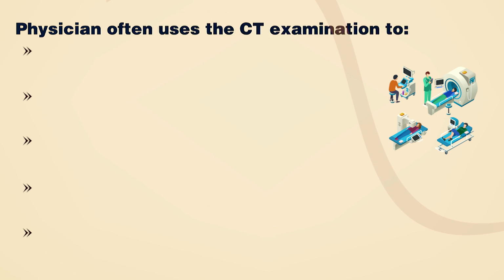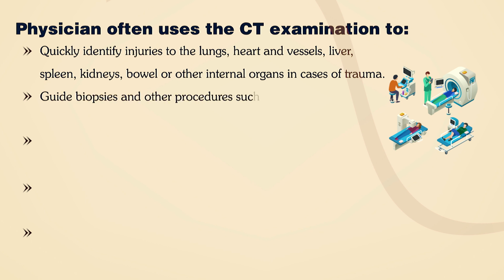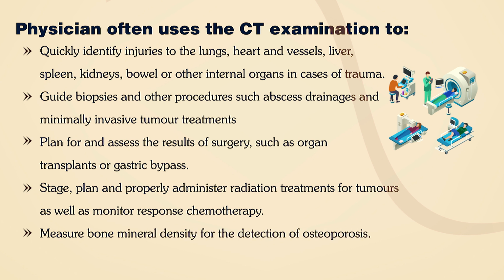Physicians often use the CT examination to quickly identify injuries to the lungs, heart and vessels, liver, spleen, kidneys, bowel or other internal organs in the case of trauma. Guide biopsies and other procedures such as abscess drainage and minimally invasive tumor treatments. Plan for and assess the results of surgery such as organ transplants or gastric bypass.